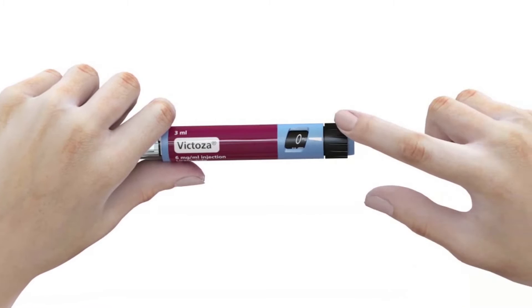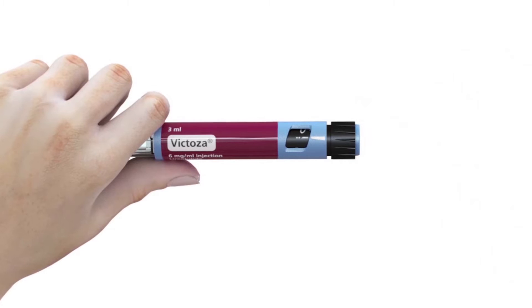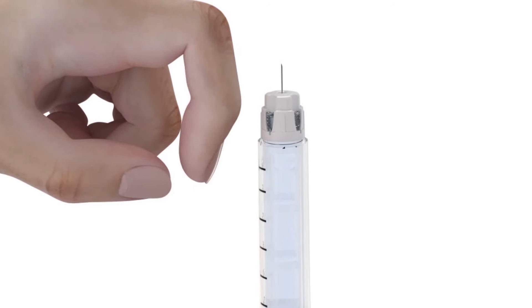The first time you use a new Victoza pen, check the flow in the pen with an air shot. Turn the dose selector until the flow check symbol lines up with the dose pointer.